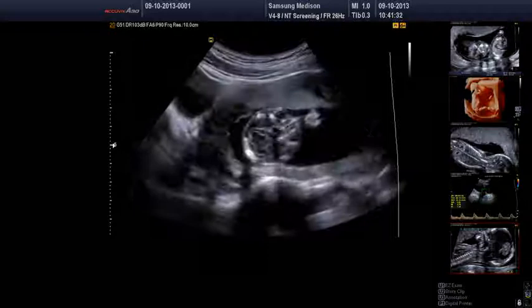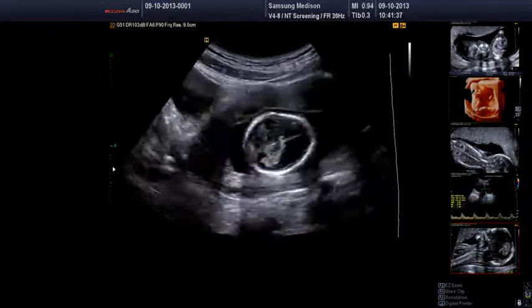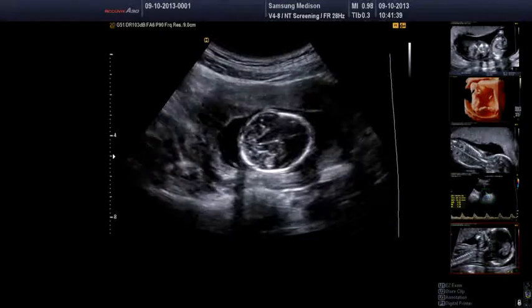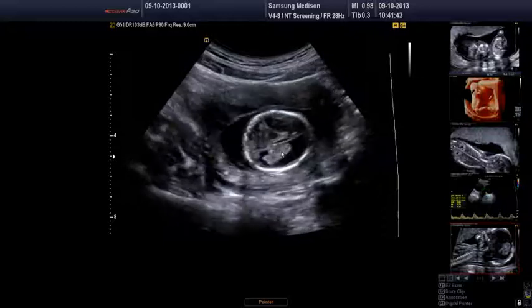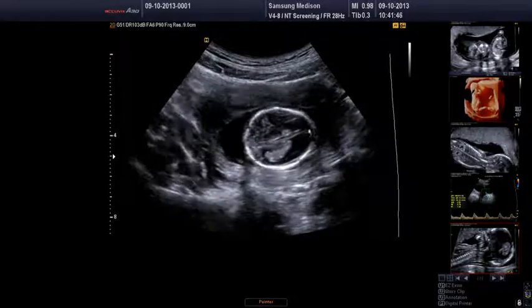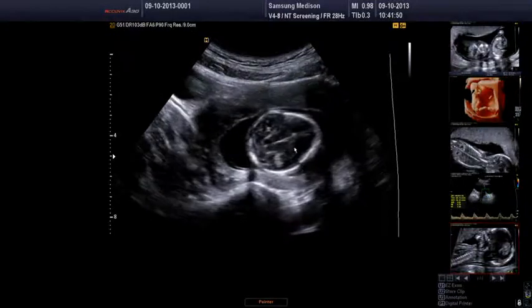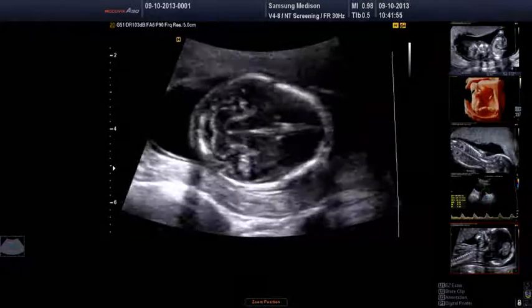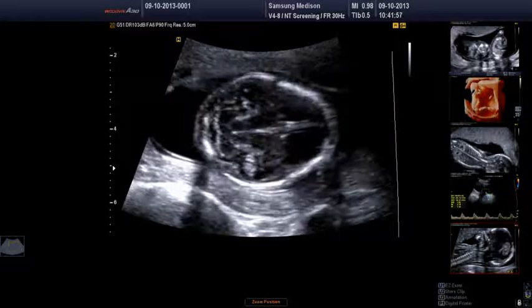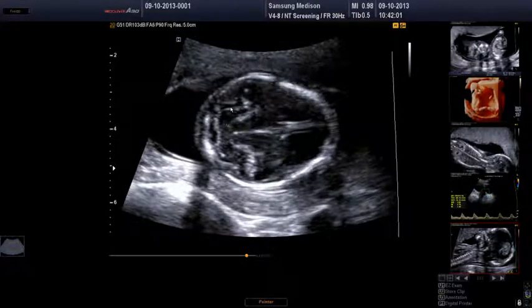Starting up at the head end again, we can obviously make sure that the cranium looks complete. We can see there's a nice echogenic bony outline to the skull. Other basic features to check as we're coming through: you can see midline development quite clearly, and you can see some symmetry there to development around the midline. As I've said before, we can then just work our way into the posterior fossa, and you can see development of the cerebellum here.